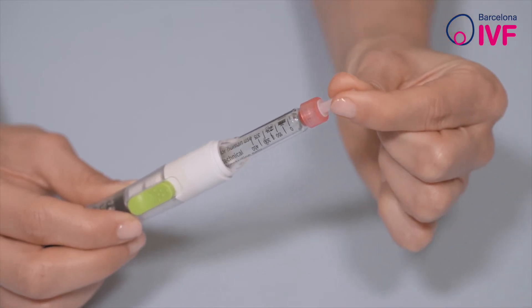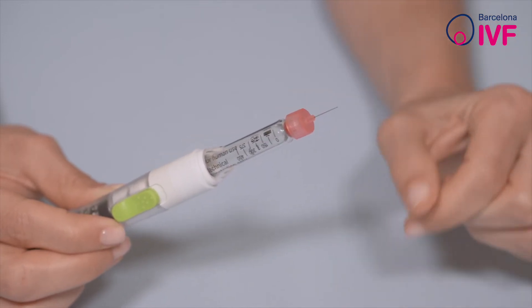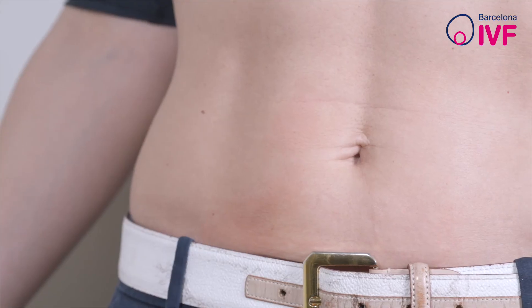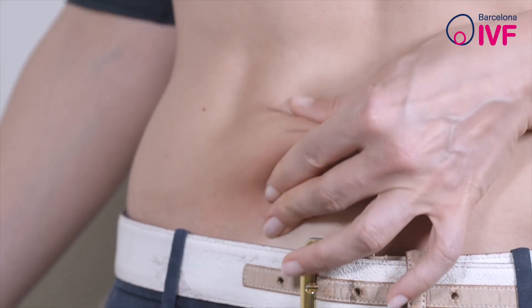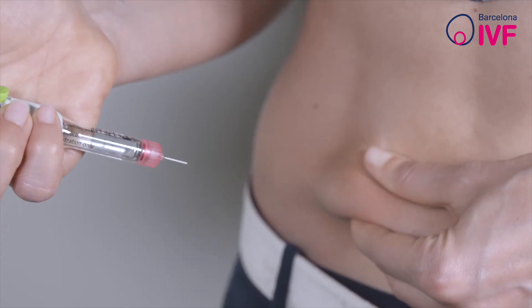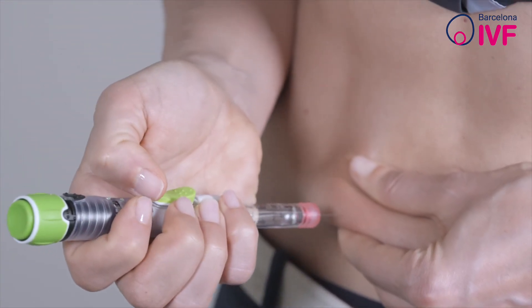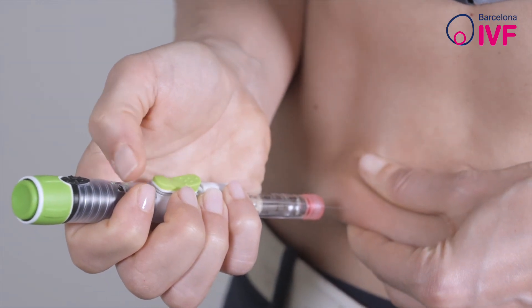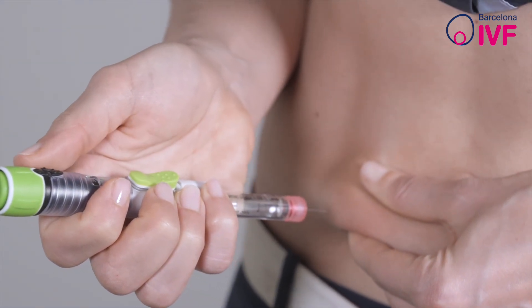Remove the needle guard. Everything is now ready for administration. Clean the abdominal area with an alcohol wipe. With one hand, pinch the area of the abdomen where the medication is going to be administered, and with the other, take the pen and insert the needle as perpendicular as possible into the skin.